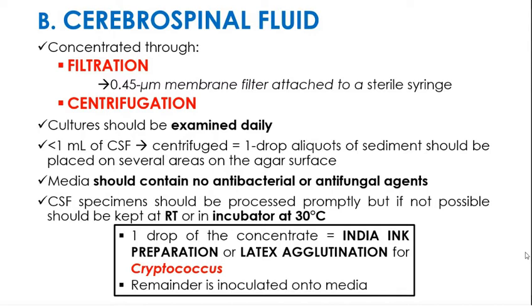centrifugation. So that with your CSF, the culture should be examined daily. And then the volume, of course, is less than 1 ml of CSF. You centrifuge to get a drop or an aliquot of that. And then yun nang ilalagay mo sa iyong agar surface. Now, with CSF, of course, we know it's sterile. So, sabi natin dito, it should contain no antibacterial or antifungal agents.